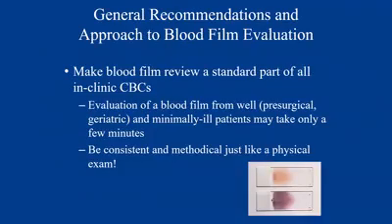So, general recommendations and approach to blood film evaluation: make blood film reviews a standard part of all clinic CBCs. This includes well patients and ill patients, okay? And the biggest thing is to be consistent and methodical with your approach, just like a physical exam. If you do things the same way every time and in the same order, it's less likely that you're going to miss something on the film.